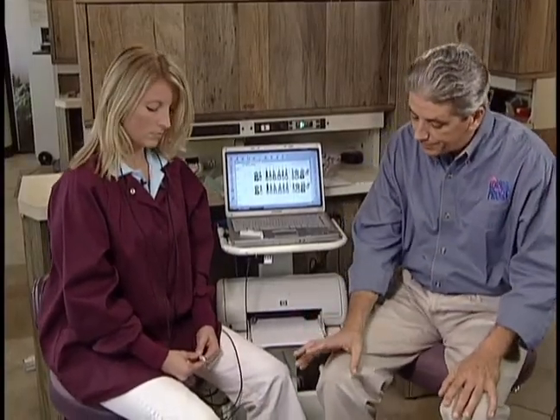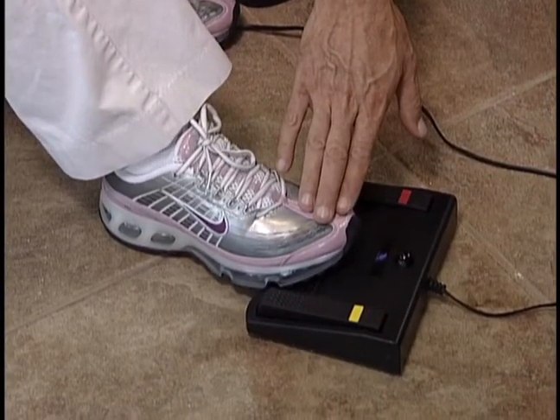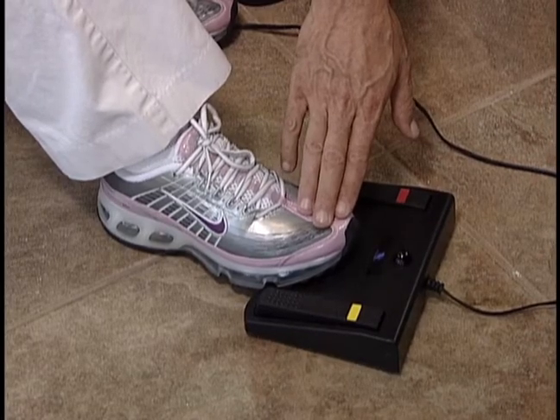Okay. Now, I want you to rest your foot and close your eyes. Just feel that foot pedal. Do you see how little movement it really takes? Mm-hmm. That's going to do a couple things for you. It's going to minimize you moving around the foot pedal and misstepping, but it's also a lot less fatiguing on your leg over the course of the day. It's going to take some practice, but when you're in the mouth, you don't want to keep looking down to your foot to see where it is, and it's all part of resting in the ergonomics of that foot pedal. Right.